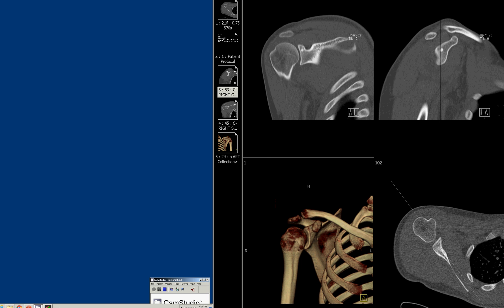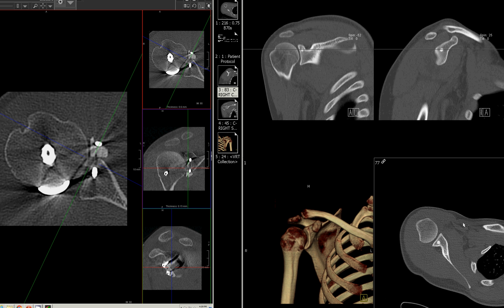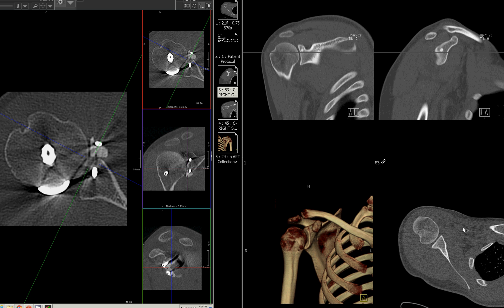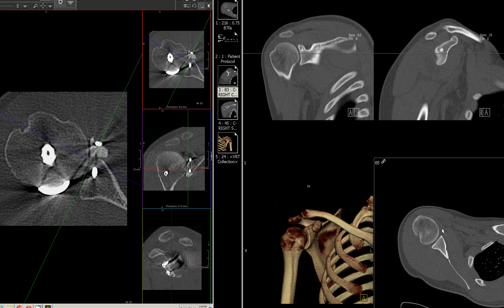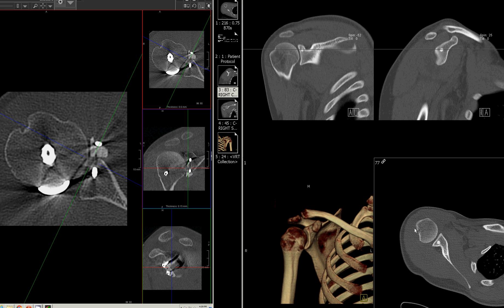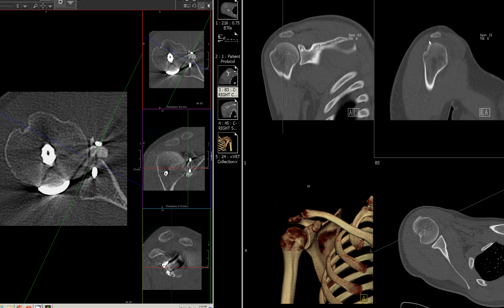I'm going to take you through a case of someone with an anterior shoulder dislocation. What happens is the humeral head pops out anteriorly and bumps against the glenoid, resulting in a big indentation on the humerus called a Hill-Sax deformity, which is visible here.